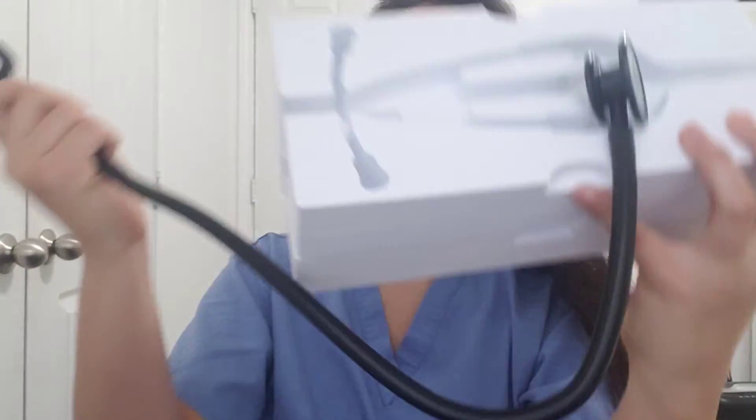Let me just take it out of the box really quick. Excuse the lighting, guys — it is raining super hard outside. I feel like I always film when it's raining so I have no good natural light right now. It's wrapped around this little mold right here. I love the way this looks — it is matte black.